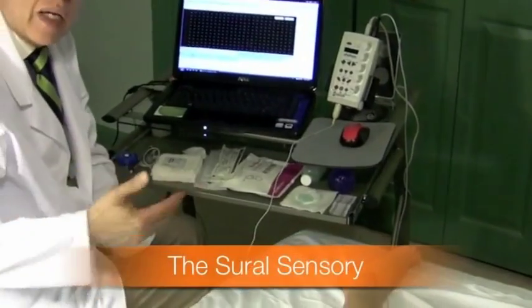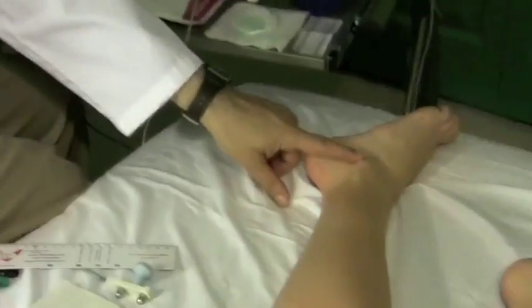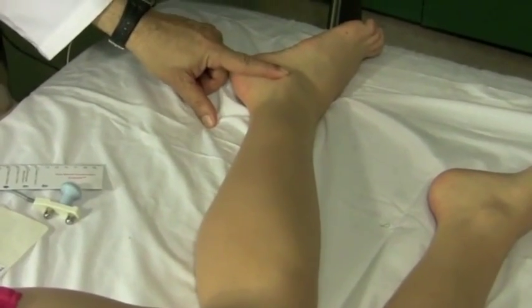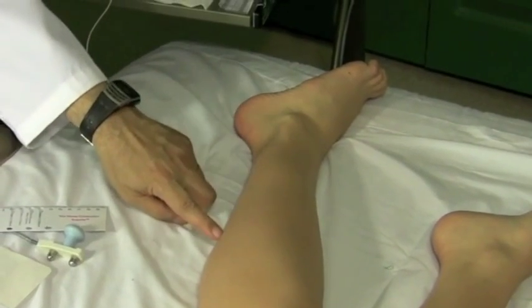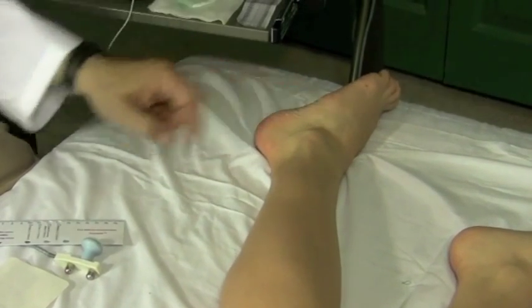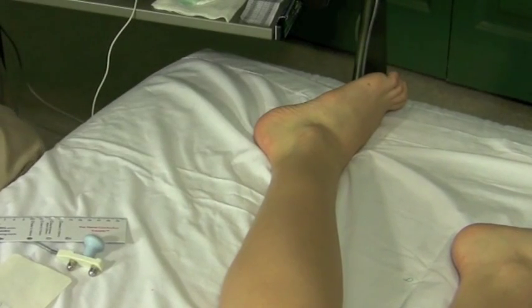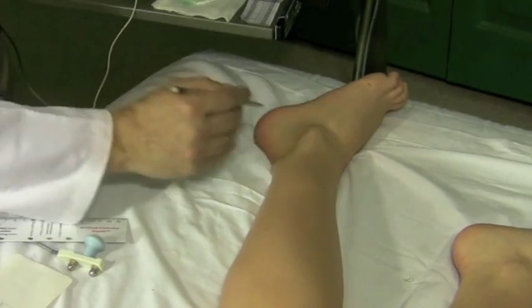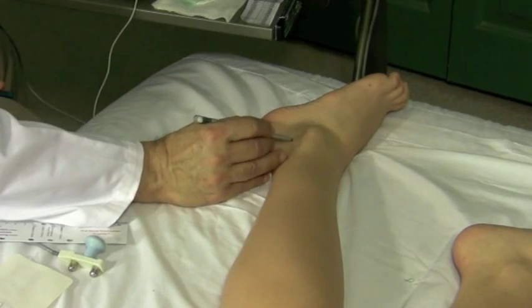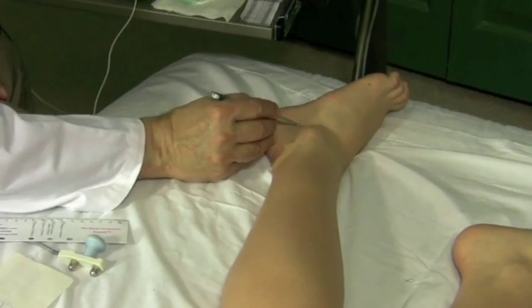So I like to start with the sural nerve. And the sural nerve is right behind the malleolus here, right behind this bone. It comes down from the calf like so, curves around it and goes around the foot. So I'm going to measure it right here. And what I'd like to do is mark the points where I'm going to put the active electrode, the black, and the reference electrode, the red.